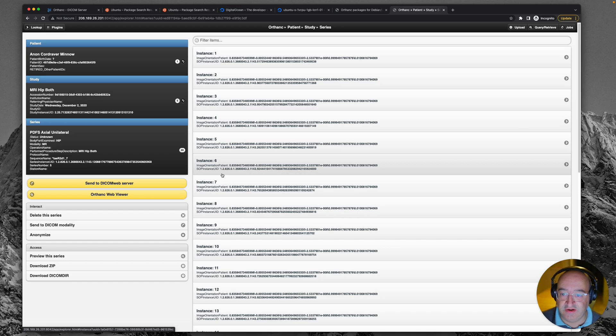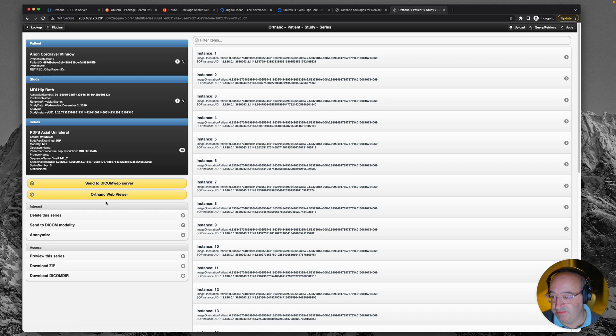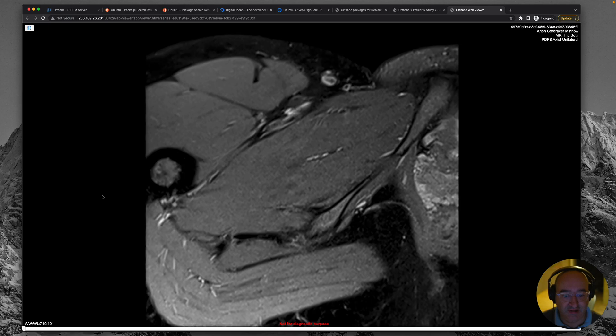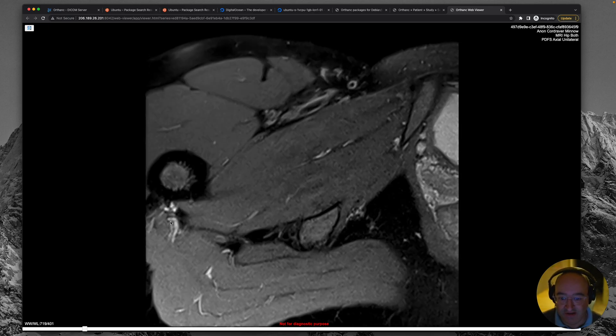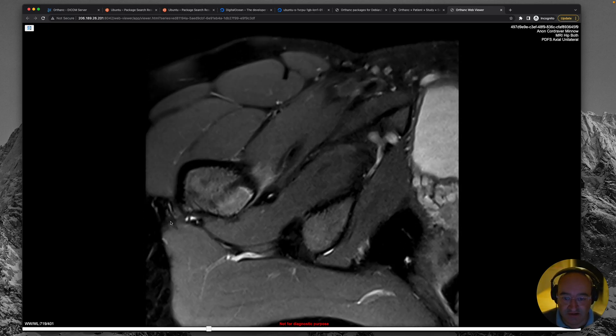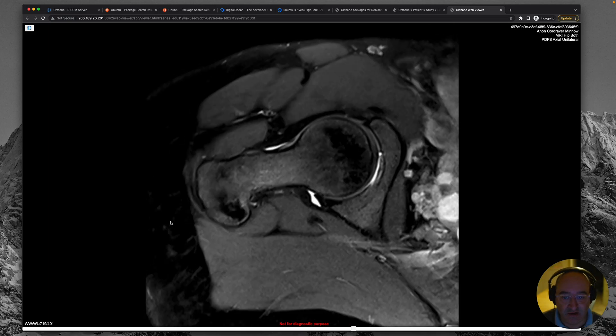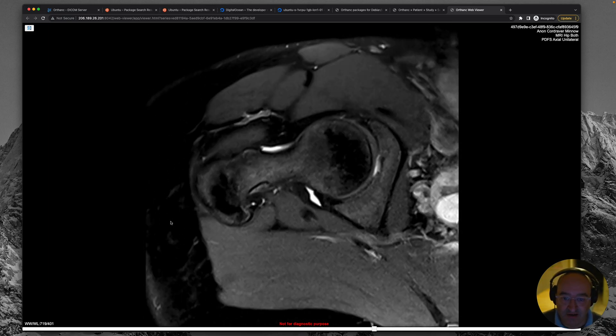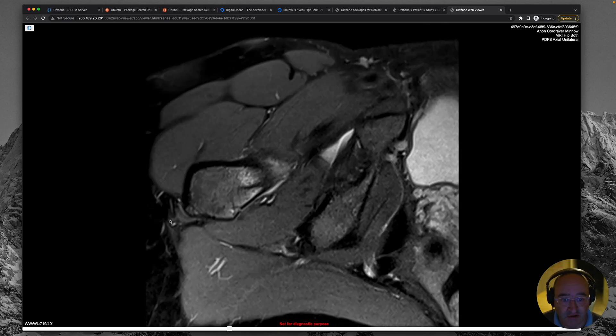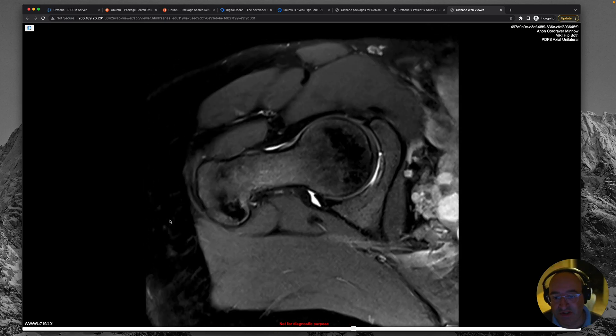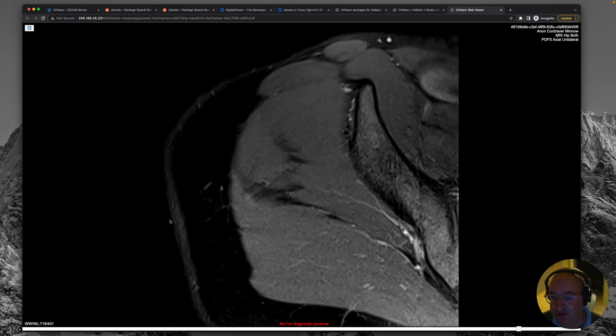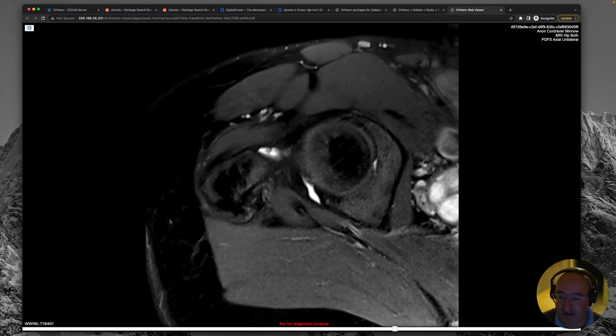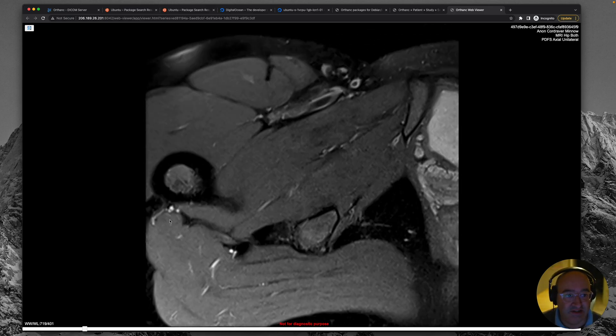Okay. I see you have to go into a series before it lets you view. And now that's given us an option to Orthanc web viewer. Oh my word. Look at that. It's like magic. Look at that. So I'm viewing some MR images of a hip on my own personal PAC server that we've just set up. And isn't that like magic? Fantastic.